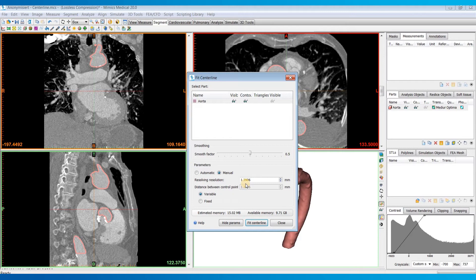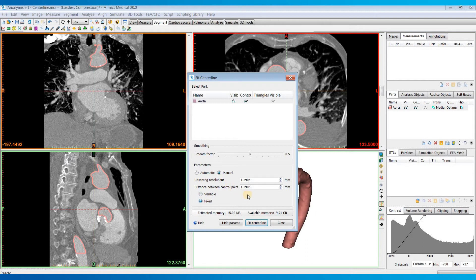Second is the Distance Between Control Point, which sets the distance between two adjacent control points between which the centerline is interpolated. Again, this is automatically set based on your images, but you can manually change it to a fixed distance if desired.